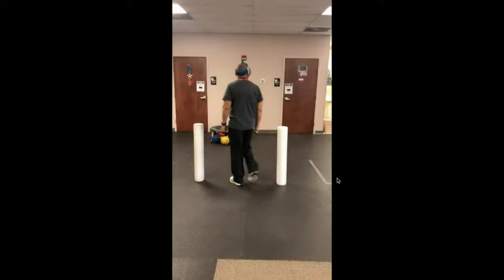This is a great application for athletes. So as they're resolving from concussion, being able to lose their visual field and come back and acquire that visual field quickly can be super important for things like soccer, football, where you literally have to have your head on a swivel and get that prediction, but you might be moving very quickly, especially on set plays in soccer from a corner kick, and people are moving around. They're leaving the goalie area and they're coming back. For headers, there's a lot of moving pieces. These can help prime them for being able to go back to that environment.